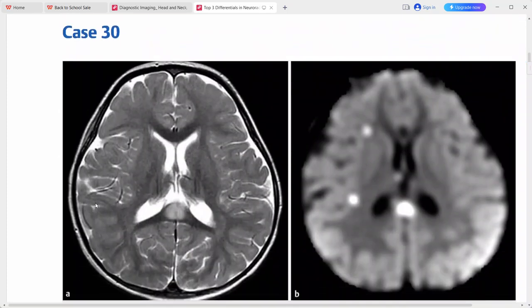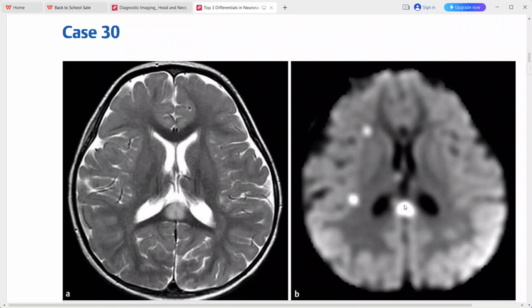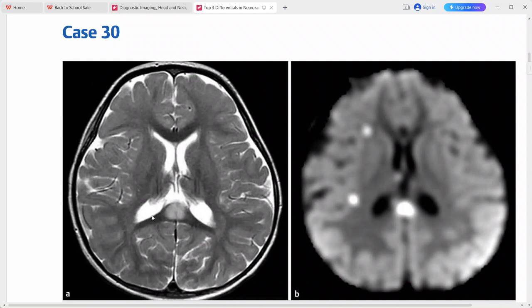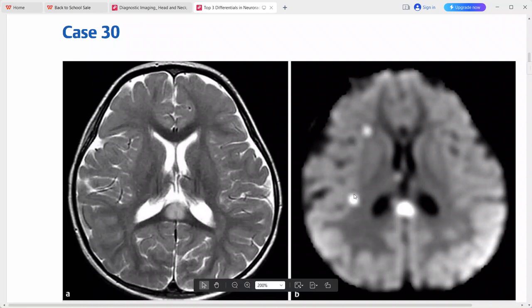This next case has the history withheld. On T2-weighted MRI and DWI, there is an ovoid region of increased signal intensity within the splenium of the corpus callosum, with correspondingly increased signal on DWI. Additional lesions are noted at the right insular gray-white matter junction and the medial right thalamus.